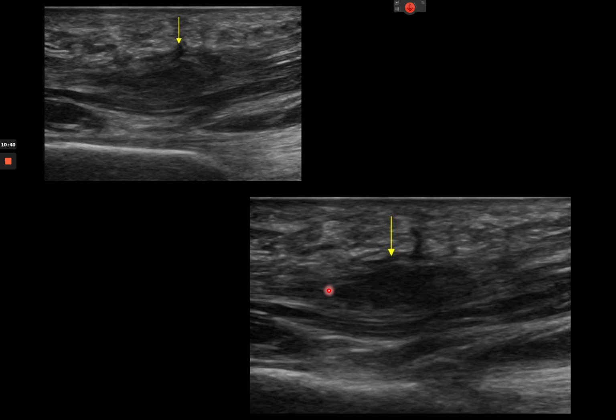And then what happens is they're managing it themselves with exercise. They might have seen the doctor or physio, and then all of a sudden they get this flare up in pain. They can't weight bear properly on the foot. They're really tender. The heel might often be swollen. Those people often have this sort of acute on chronic flare in pain. And when you scan them, there'll be 9 out of 10 times a split or a delamination tear in the plantar fascia. Because it's more of a continuation, right?